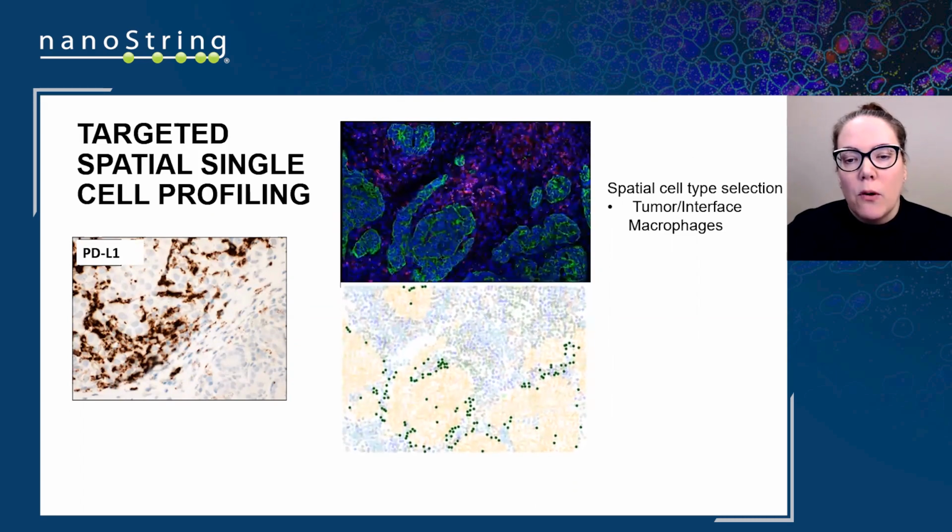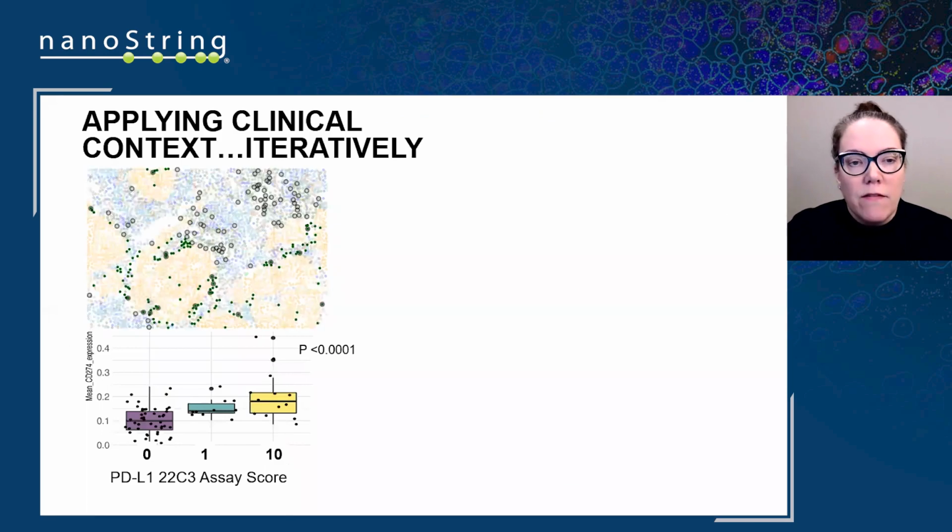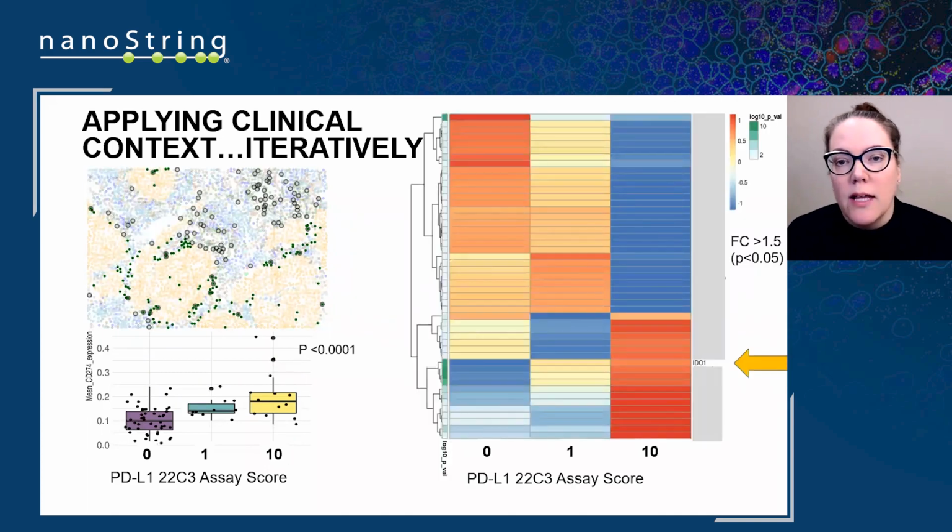And then we superimpose on those green macrophages where the PD-L1 positivity is. We do an internal control check, which is me as the pathologist going back and looking at the clinical reads from these cores and making sure that the RNA is picking out the appropriate cell population. We verify that it has a very strong association with the clinical assay, so it's performing very well. And then we do a whole series of differential expressions, and we do them iteratively. This is just the first stop on the pathway.